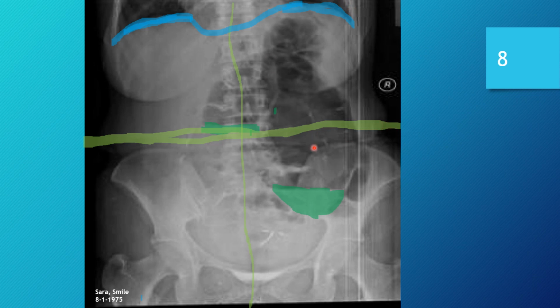Now you're probably wondering why I'm saying presumed right side when we have an anatomical marker here. This marker, it's a bit difficult to tell, but it almost to me looks like it might be reversed. So if that's the case, this image has been presented wrong. That marker should be on this side in the presentation to indicate the right side.